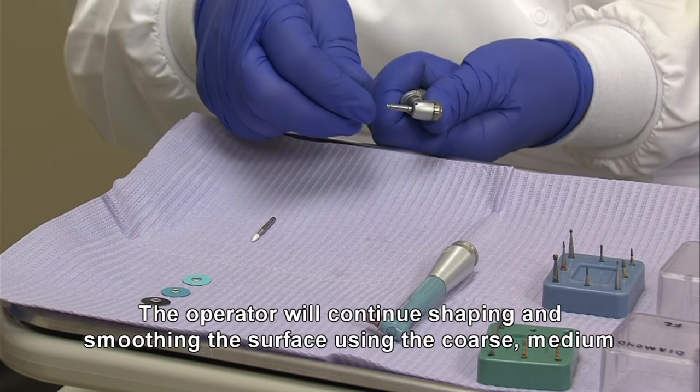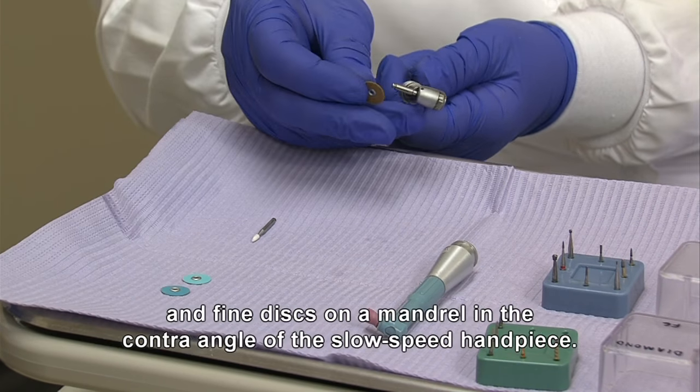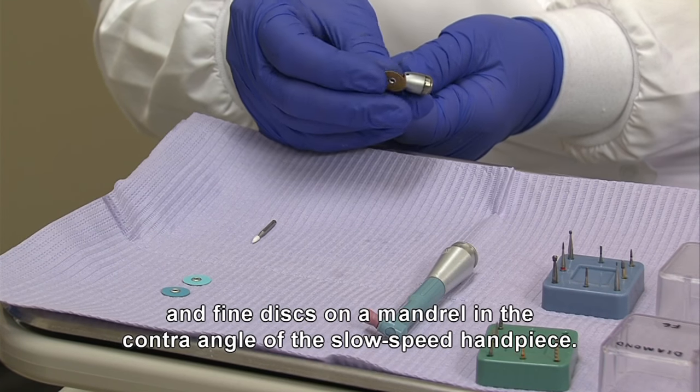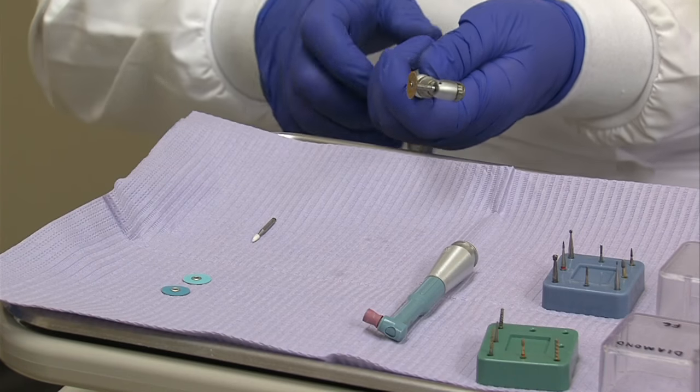The operator will continue shaping and smoothing the surface using the coarse, medium, and fine discs on a mandrel in the contra angle of the slow speed handpiece.